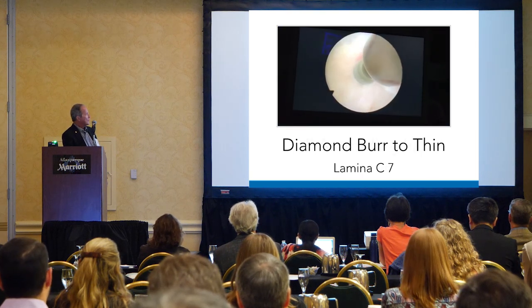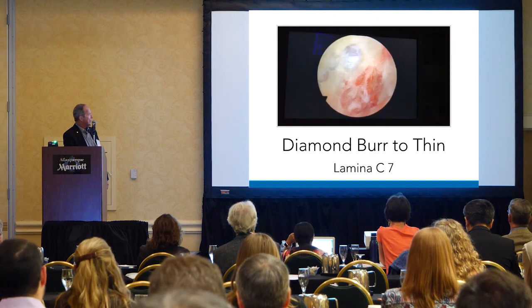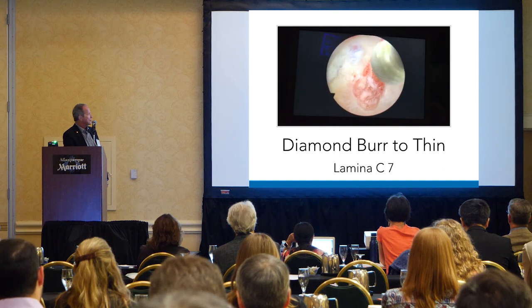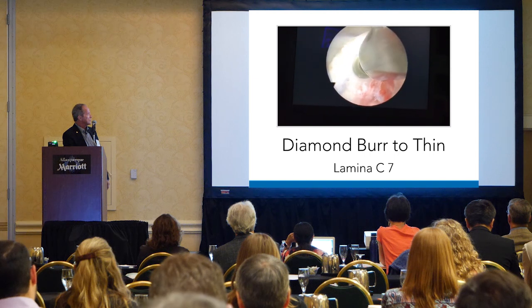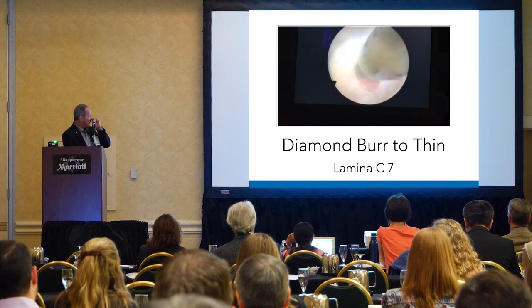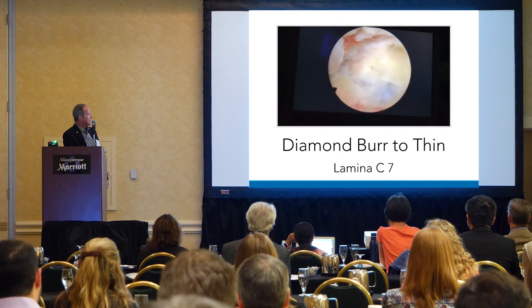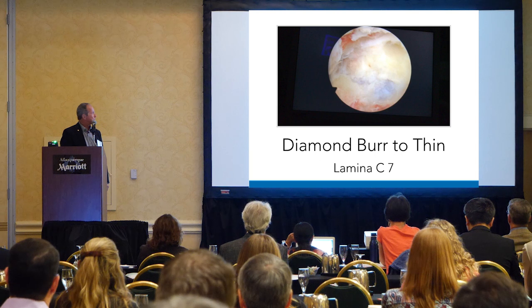When we thin it out enough with the oval burr, we're going to switch to the diamond burr. This does two things. One, it reduces the possibility of bleeding. And number two, you have much firmer, finer control. You can just go down, and if you poke through a little bit, the burr is going to protect you from going too far into the spinal canal.